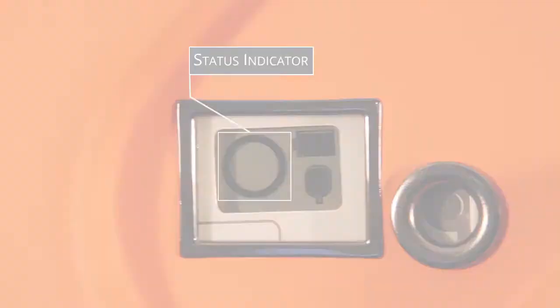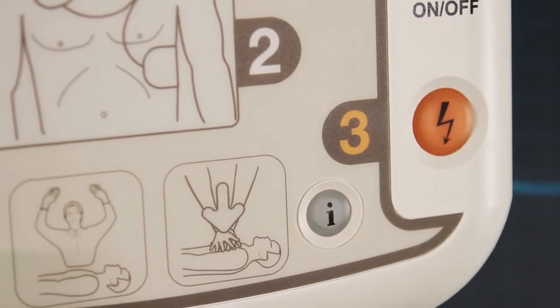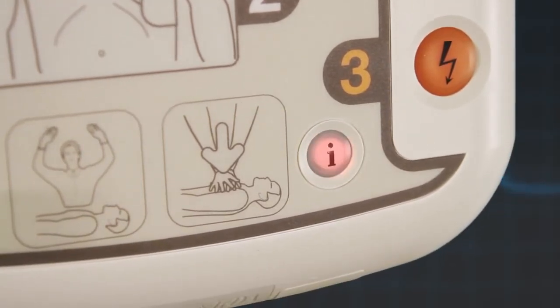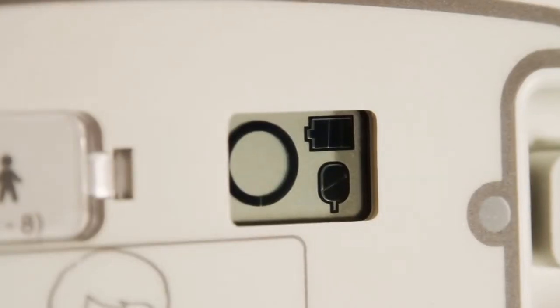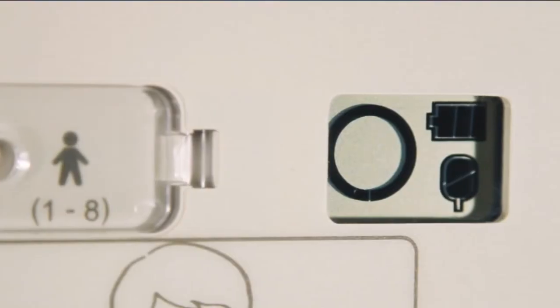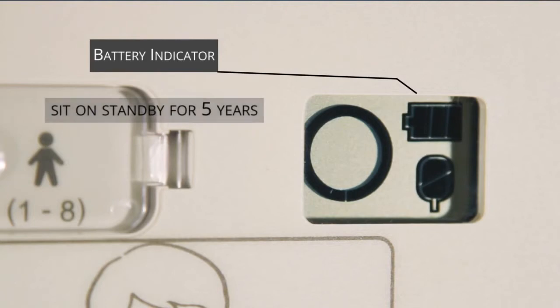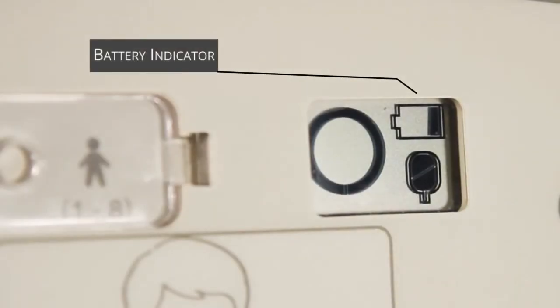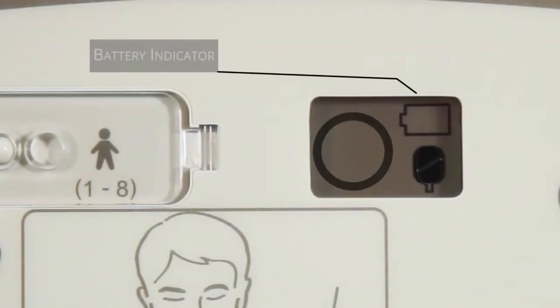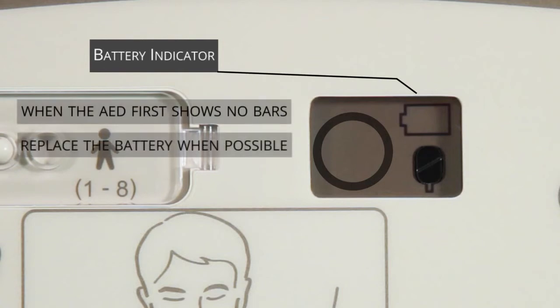If a problem has been found, the indicator will change to show a cross and the I button will flash red. Press the flashing red I button and the iPad SP1 will verbally tell you more about the issue. Secondly, the battery status indicator will inform you of how much battery power remains in the non-rechargeable battery. When installed, the battery has enough power to sit on standby for five years. When the battery indicator is at one bar, a new battery should be ordered.